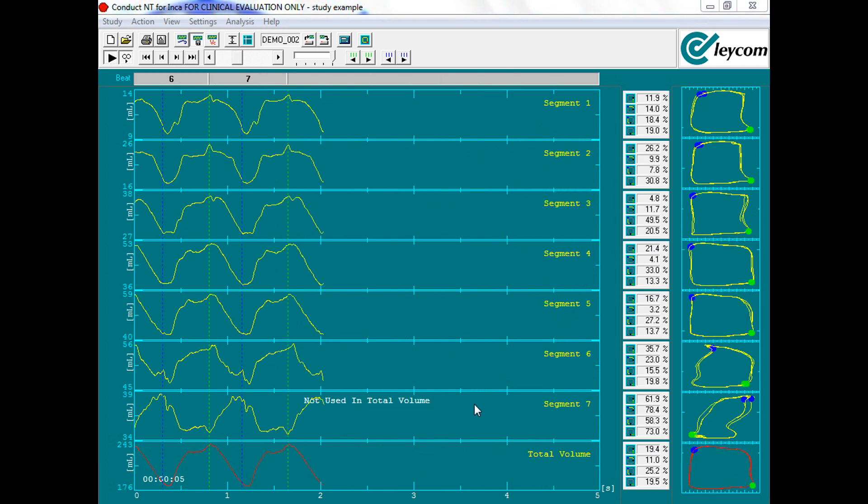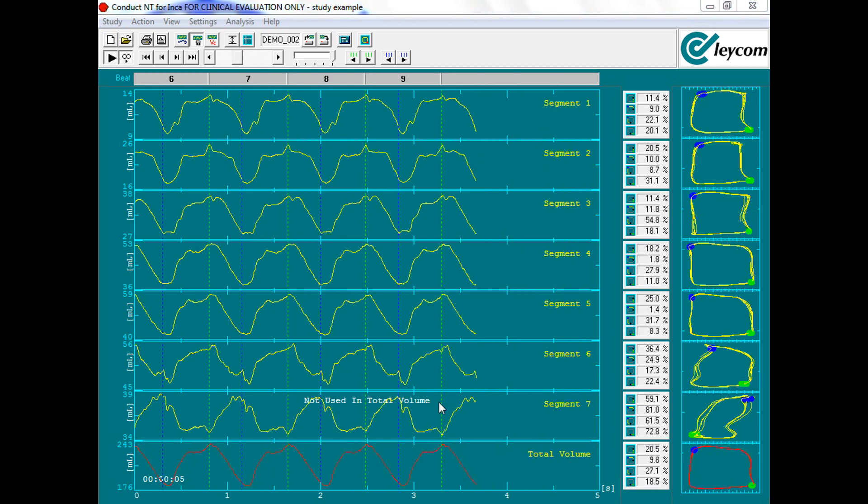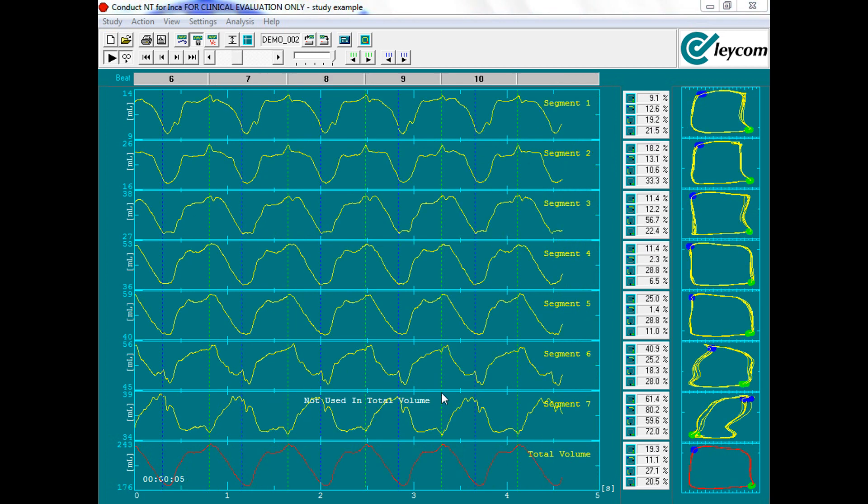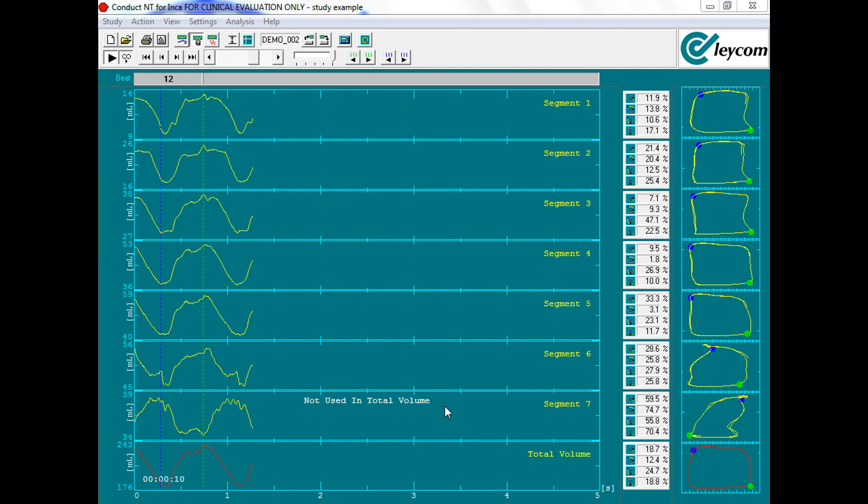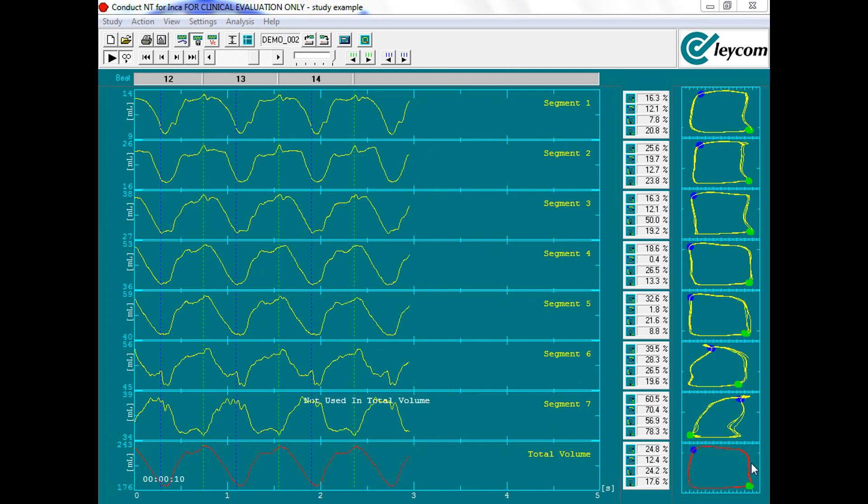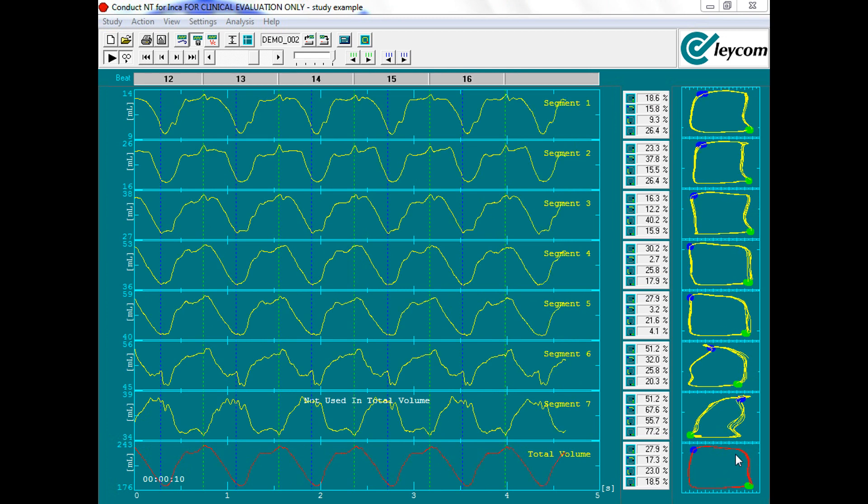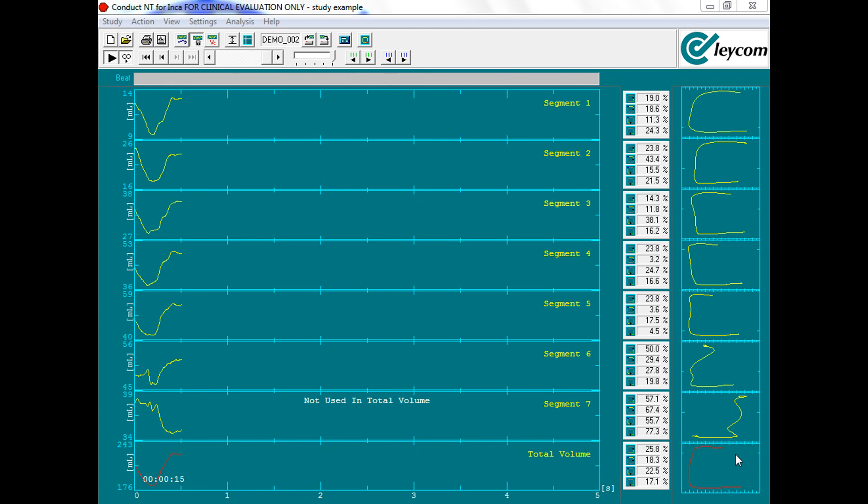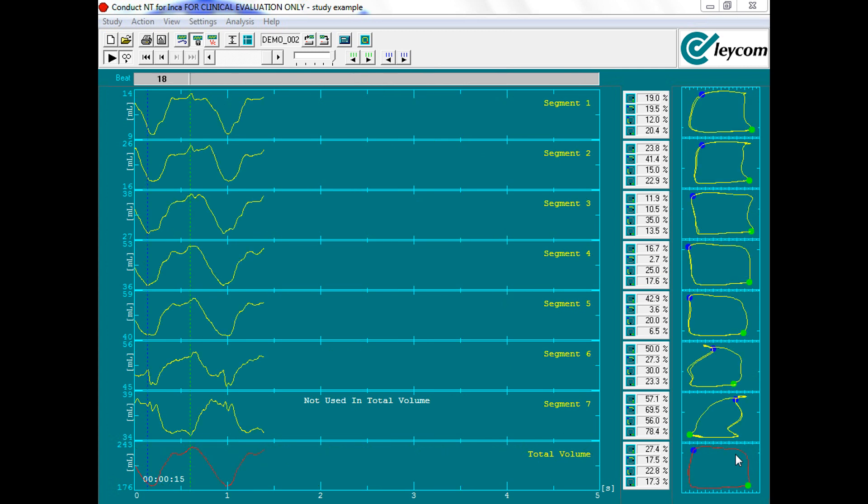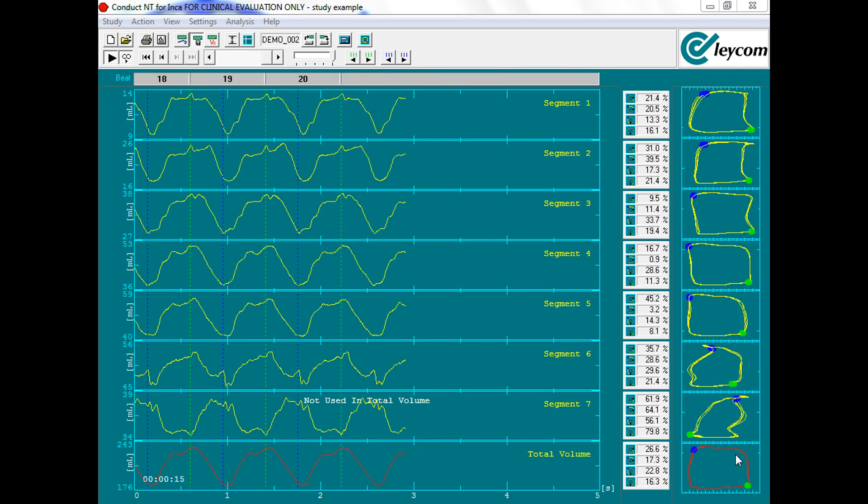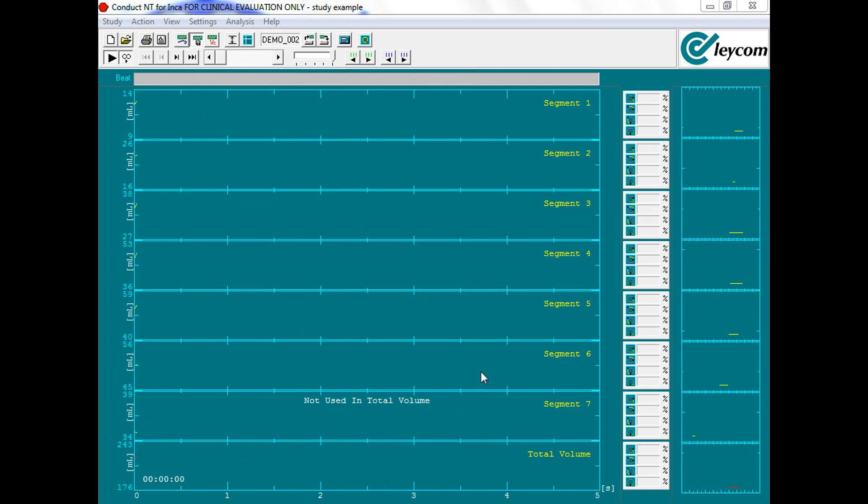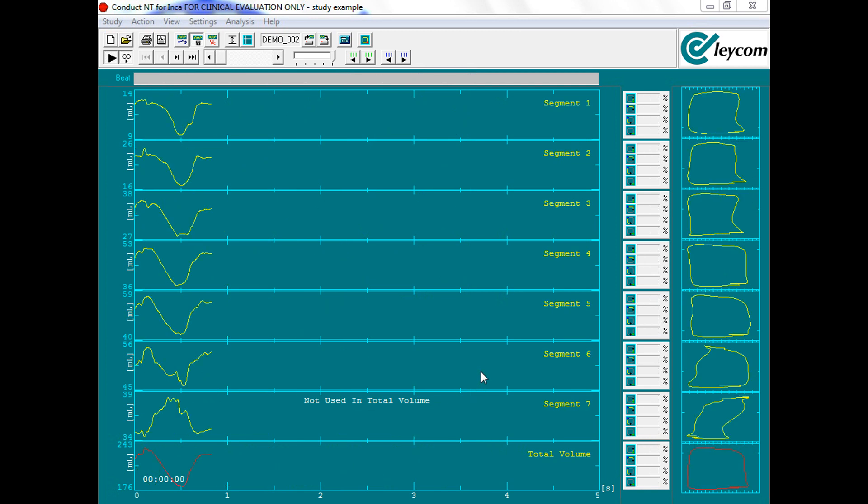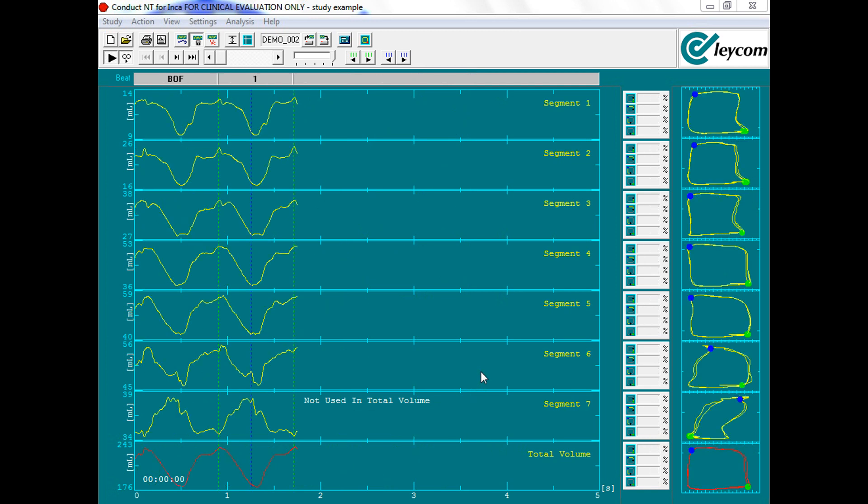From here, white text will appear indicating segments not used in the total volume calculation, and an automatic rescale will apply to the total volume PV loop. Please recall the INCA System acts as a black box, thus inclusion or exclusion of any segments can be done offline in post-processing data analysis.